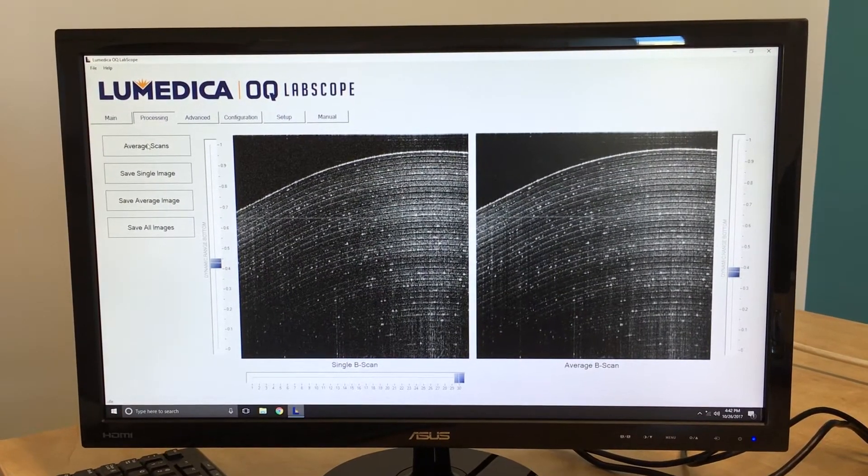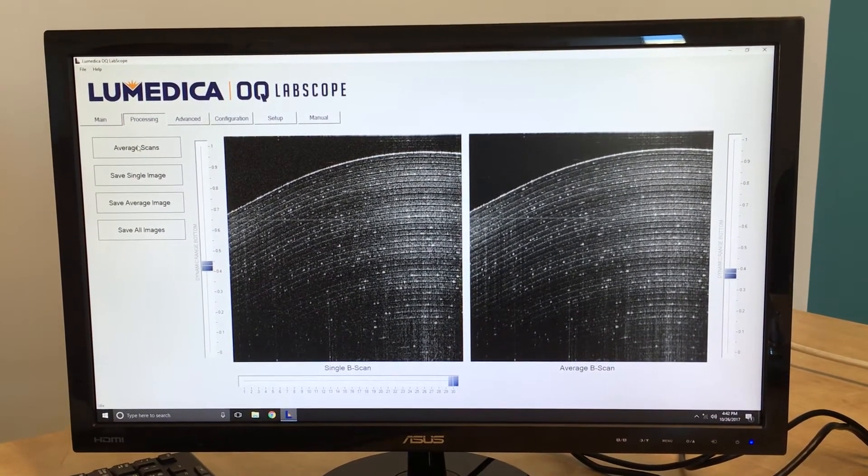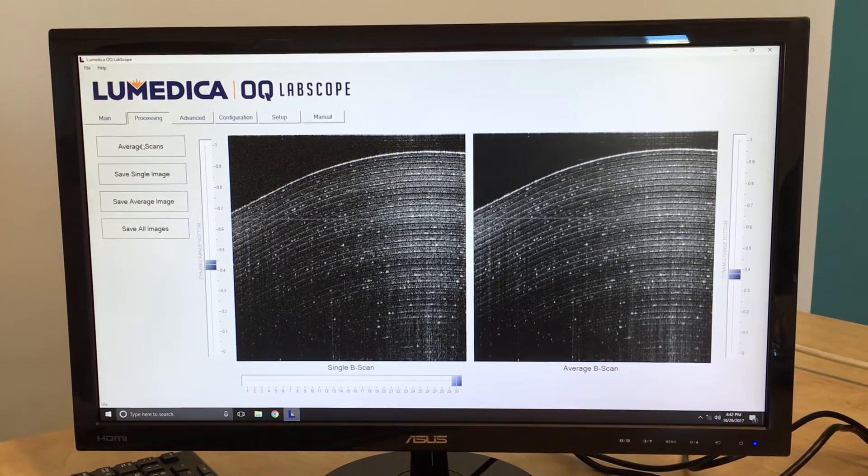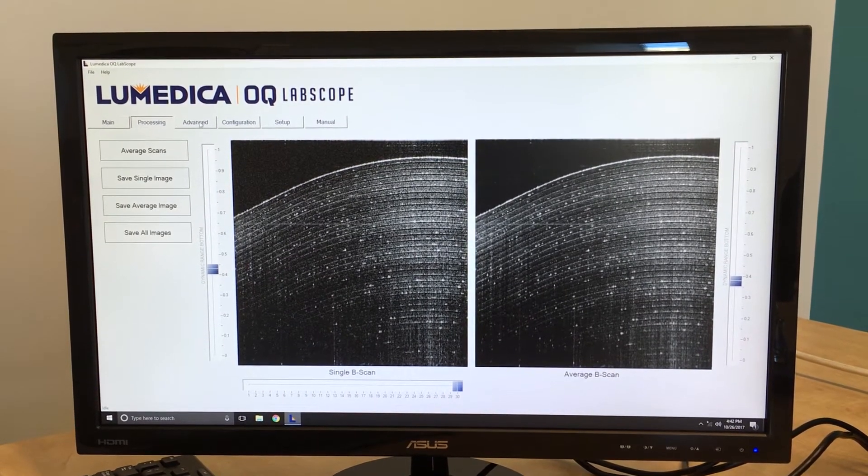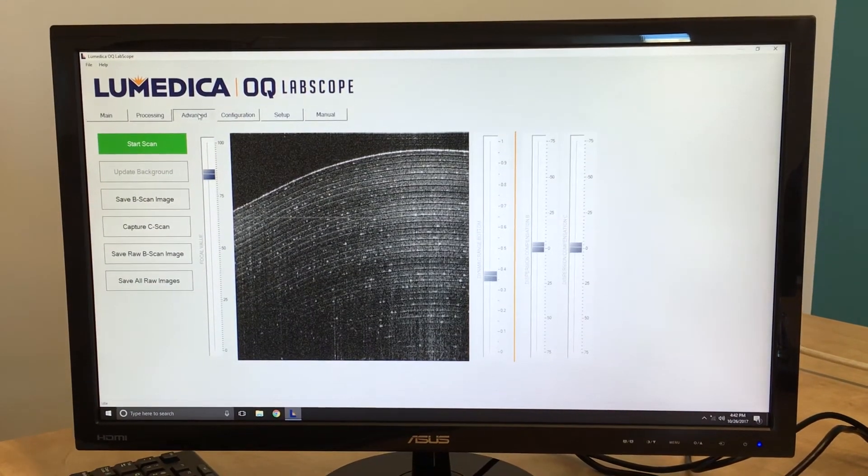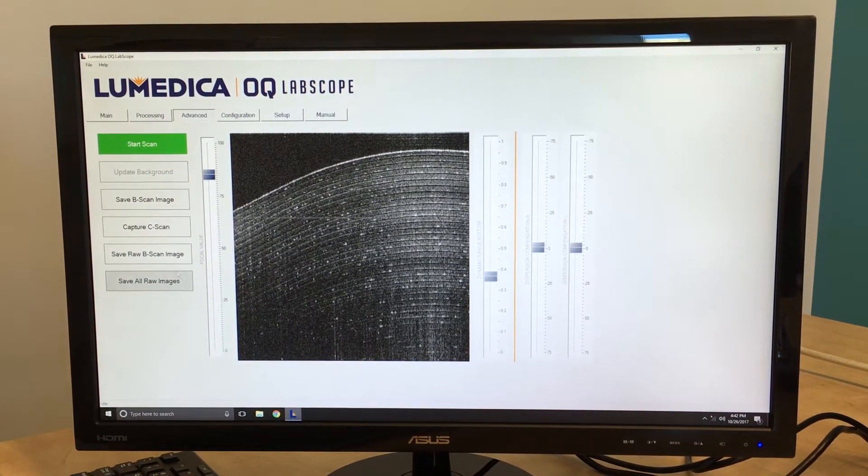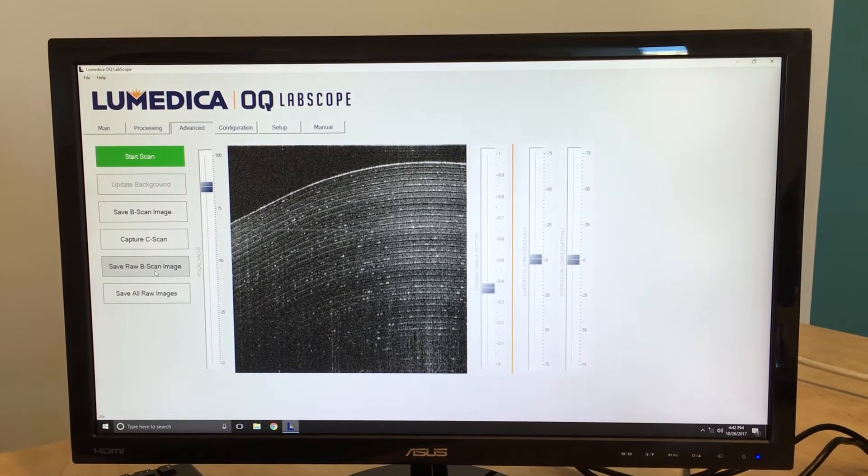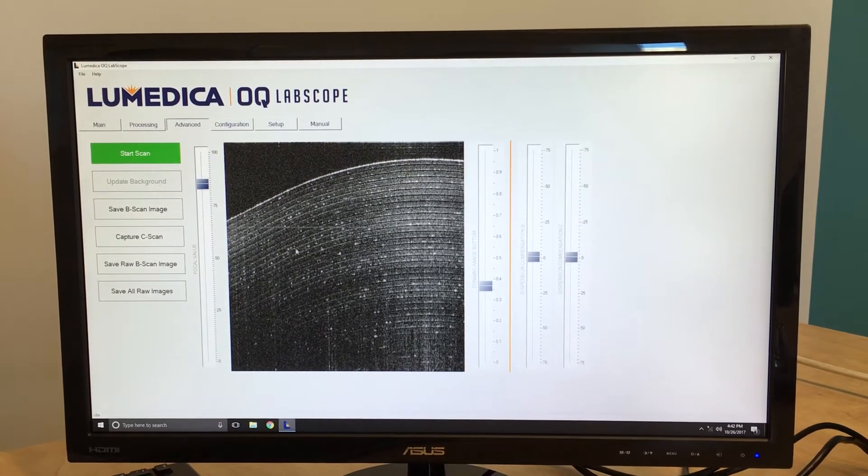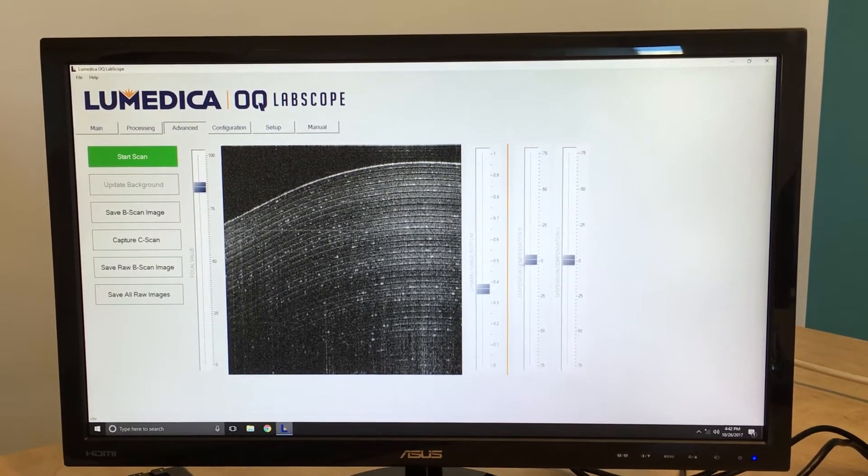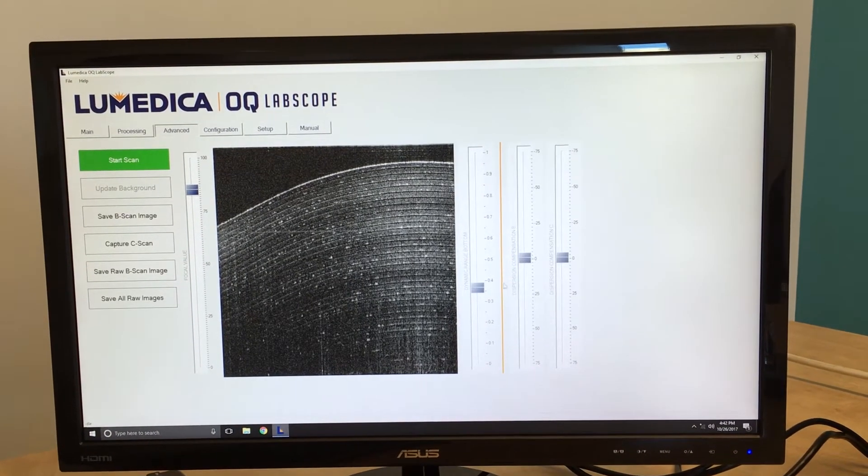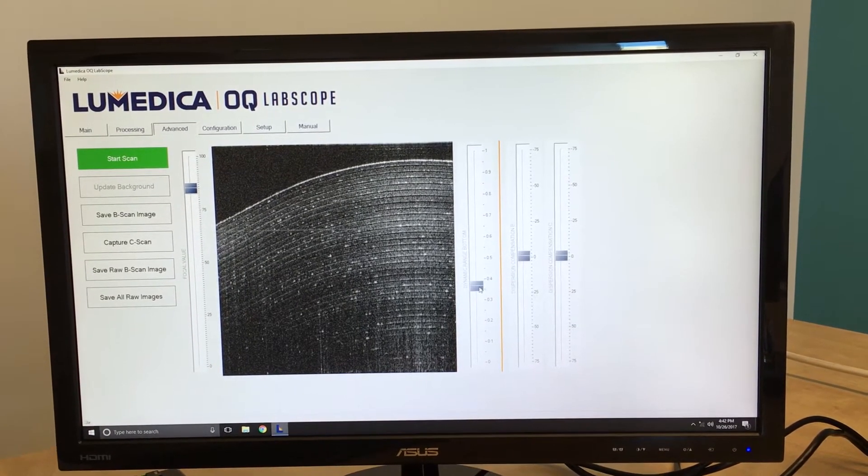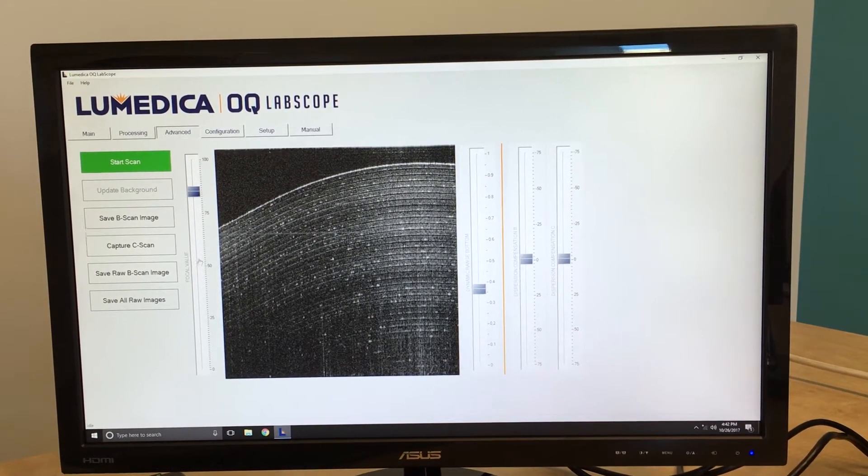Experienced users of OCT may want access to the raw image data. In that case, simply click on the Advanced tab, and you have the ability to save raw B-Scan images, as well as to change various imaging parameters, such as dispersion compensation, the dynamic range of the image, or even to adjust the focus.